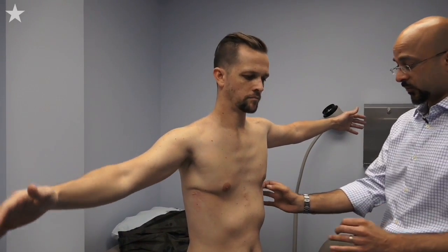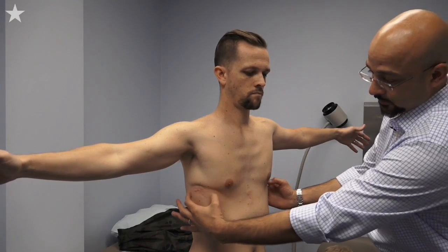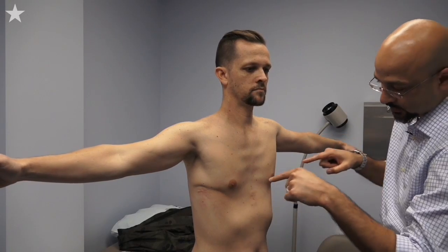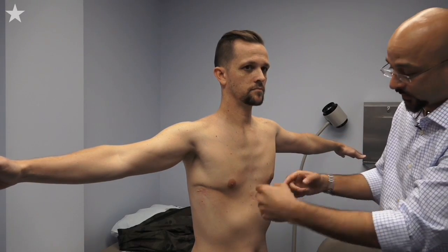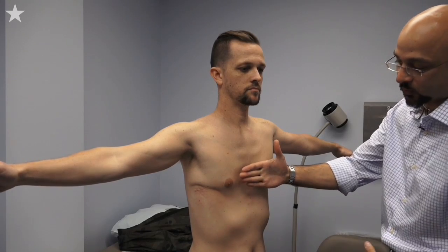So he's got the incisions here and here, and the bar is just underneath the skin from here to here. Then right here, in between the ribs, it dives in between the ribs and is behind the rib cage from here to here — and that's what's holding his chest up.